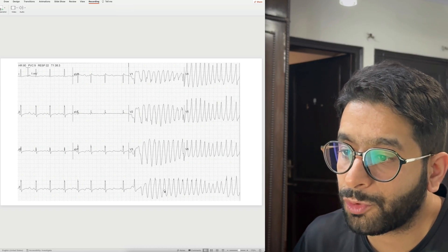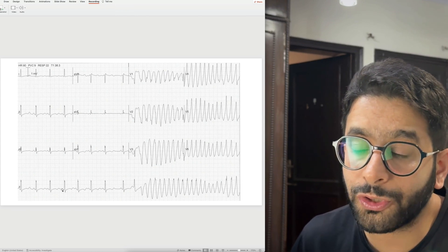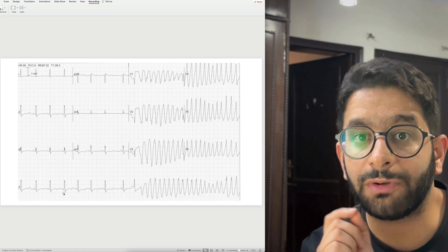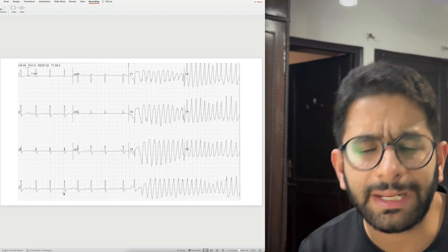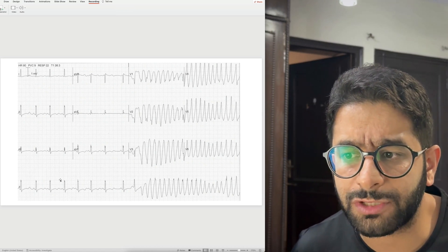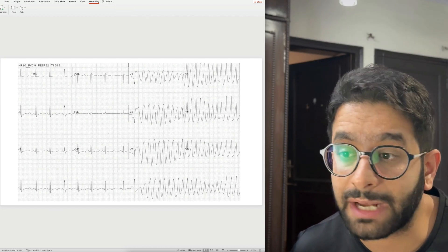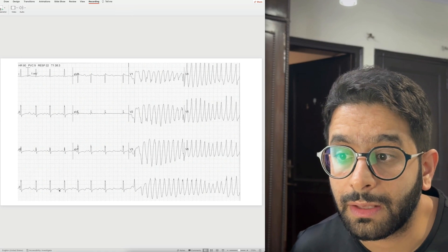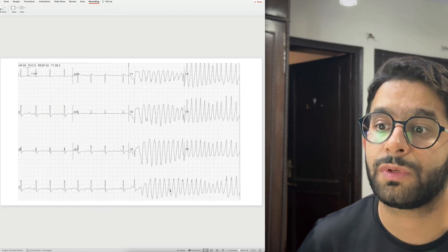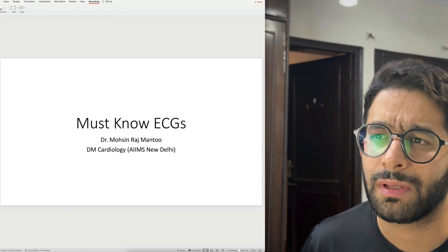This next case is also VT — a wide complex tachycardia — but the QRS complexes have different morphologies and appear to twist around a middle point: positive, then negative, then positive again. This is polymorphic ventricular tachycardia. In the setting of a prolonged QT interval, this is known as Torsades de Pointes — a lethal arrhythmia. This patient had hypokalemia: a common scenario in elderly patients on diuretics who develop low potassium, QT prolongation, prominent U waves, and then Torsades de Pointes.